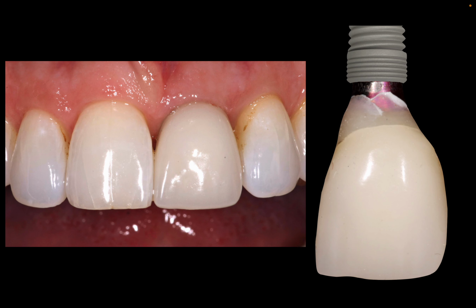Now, returning to Barbara, here's her provisional, right? We can take a look at it, and it doesn't look too bad. However, if you look at the mesial papilla, it's lacking full tissue fill. So this would be a 1. The trick is, can we get it to a 2? That would be really nice. If we got this end result, this wouldn't be half bad. You can also take a look at the distal papilla of that provisional, and you can see how the narrow triangular shaped tooth exacerbates the look that's not quite right.